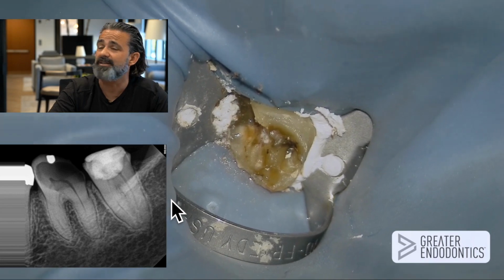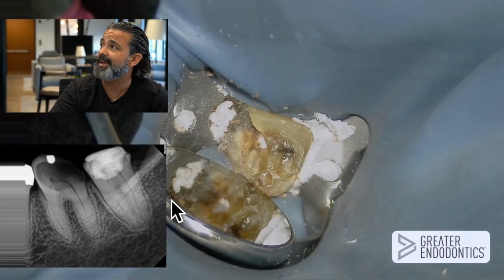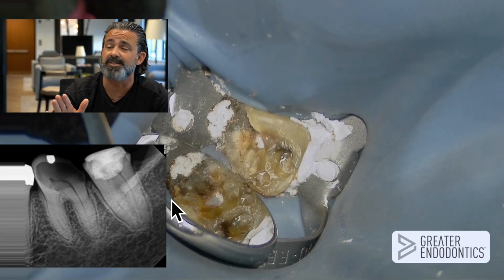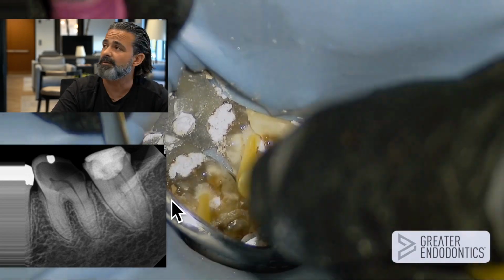I'm going to go right to the sound seal. Now, why would I do that? Well, the main thing is it's a conforming resin, and I'm making the choice right now to bond that puppy into place as you see it, because I don't want any leaks and I want to run the GentleWave. That was my decision. So isopropyl alcohol everywhere, blow it dry.